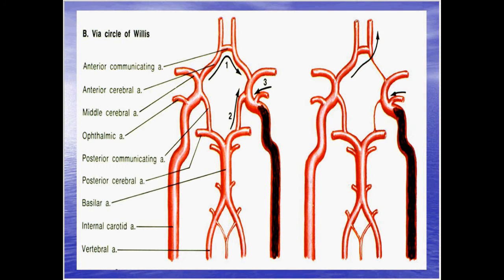All right, so again, if you have the bridge open here, what are your flows going to look like? You've got flows from the one side of the brain crossing over. Think of it as the troops going over and protecting. They're helping out protecting the other side of the brain, sending flows back into the middle, okay? Because we've got a blockage down here. So this is crossover collateral, if you think about it like that.